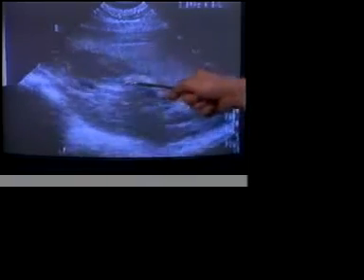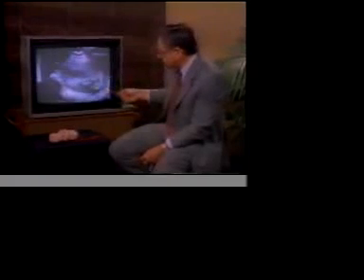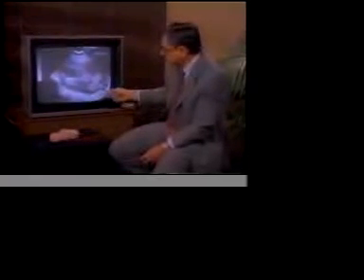But once the fluid has been drained off, the suction tip has now been firmly clamped to the child's body, and the child is being pulled in a downward direction by the abortionist's suction tip with the negative pressure applied to it, and the body is now being torn systematically from the head of the child, being in this direction here. I am now outlining the child's head.